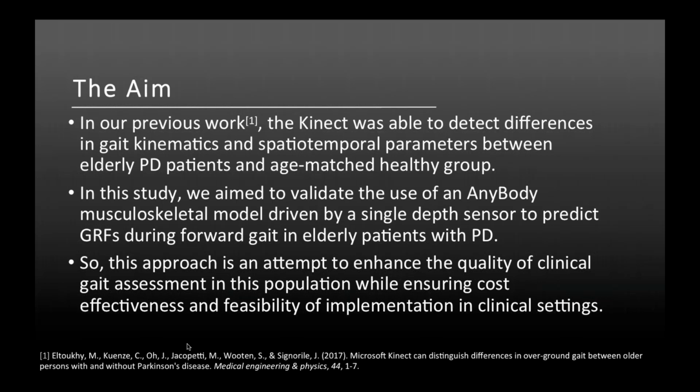Once we were able to achieve this point in the study that I'm going through with you today, we wanted to validate the use of an AnyBody musculoskeletal model that can be driven by a single depth sensor, in this case Kinect, that can enable us to predict ground reaction forces during forward gait in elderly patients with PD.